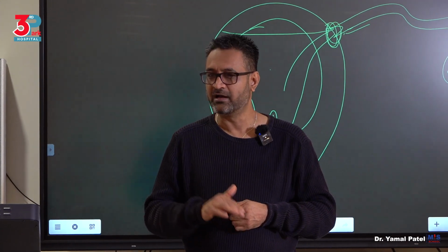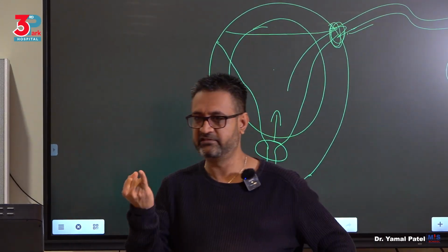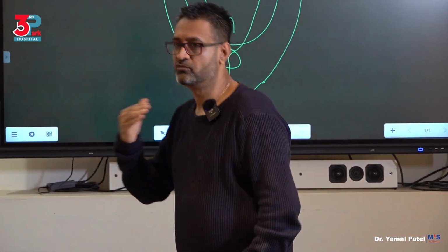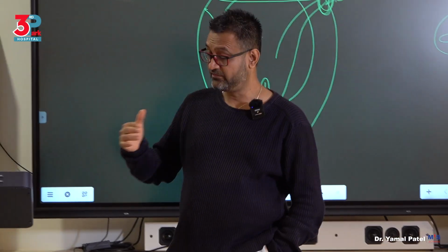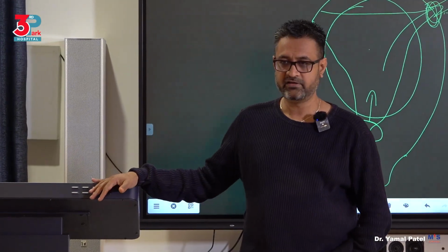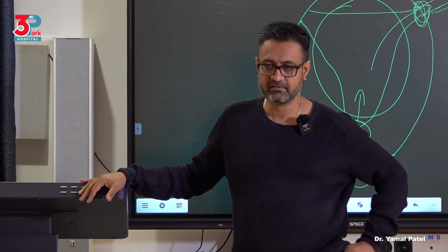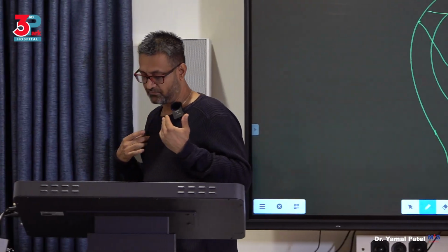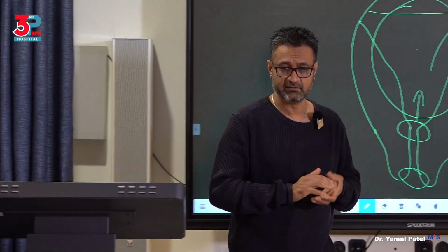So you should know your cutoffs. So number one, know your pressure settings that I've told you. The flow rate can be set at 200 to 400. So flow rate 200 to 400, pressures at or below 100, play around the MAP, okay? Number three, when you're talking of the volume of fluid used, that's the third important parameter.